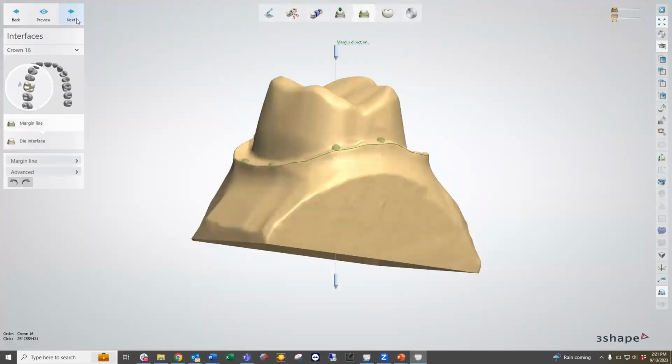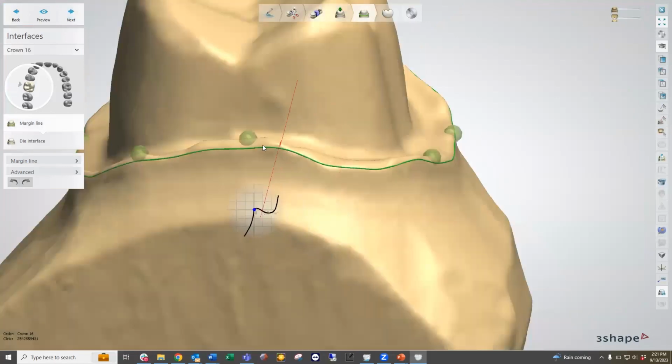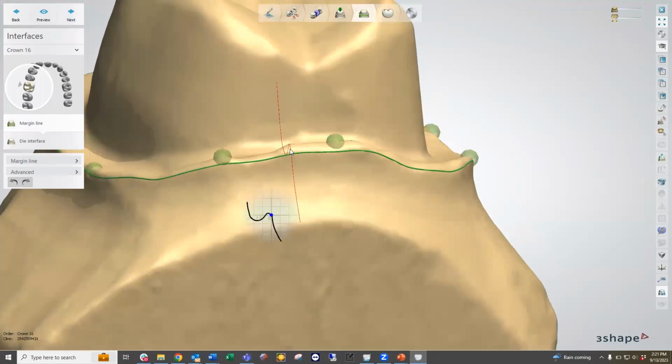So next we're going to go into the interfaces step. And this one's a little bit more crucial because we do have two sub-steps underneath here. We have the margin line, and then we have the die interface. The margin line is just as we see here, the individual margin line, which is going to be the finishing line of the unit and the preparation.